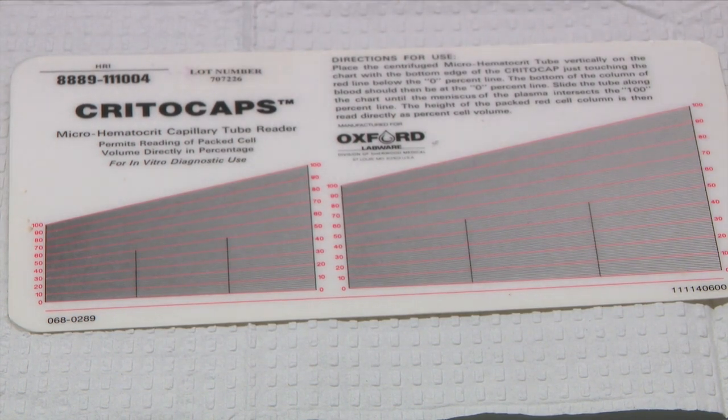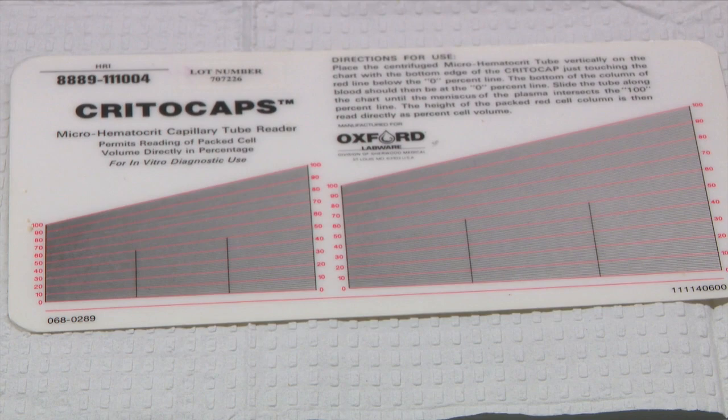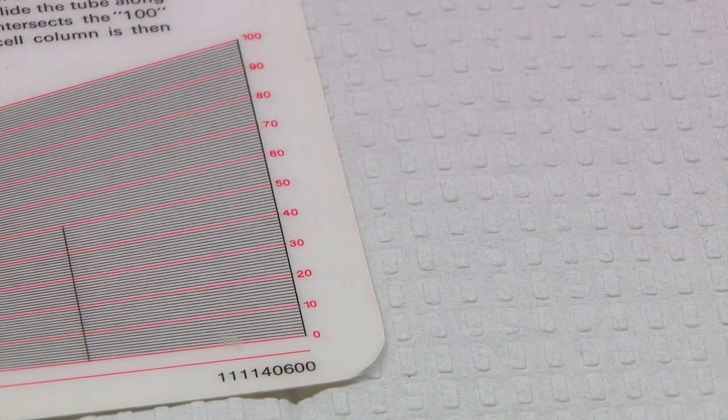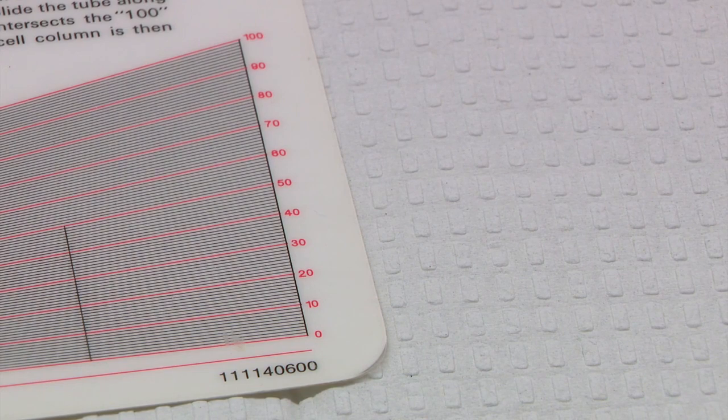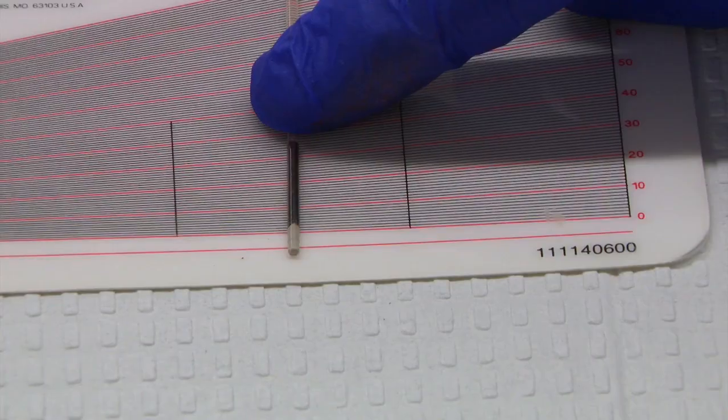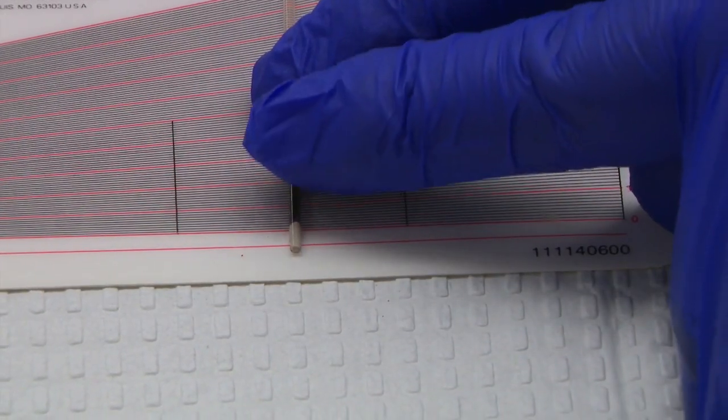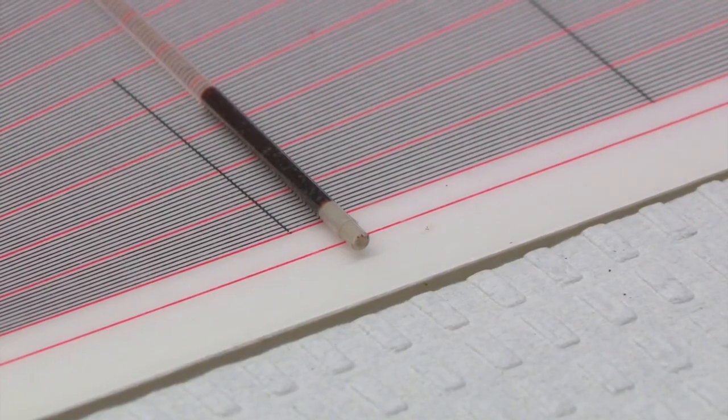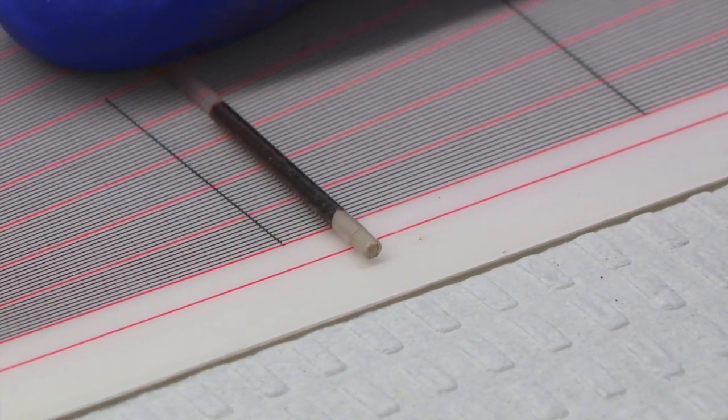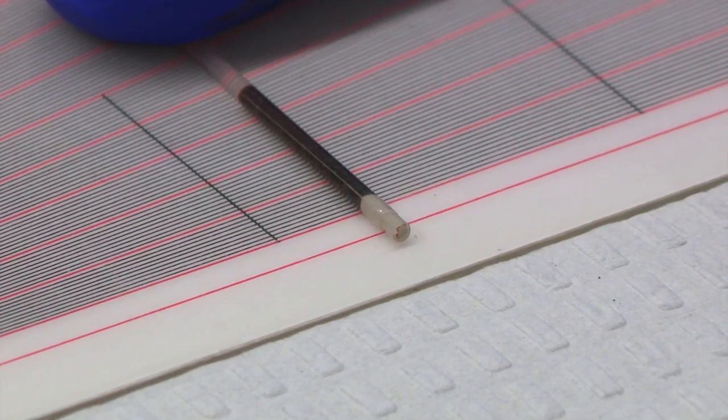However, if there is a low volume, the chart on the left would be used. Notice on the reader there is a zero mark at the bottom and a 100 mark at the top. To begin reading the tubes, lay the reader flat on the table and align the area of the hematocrit tube where the packed red cells and the clay meet at the zero mark.